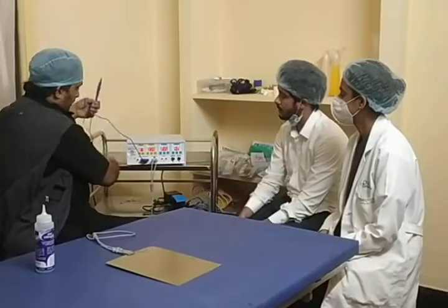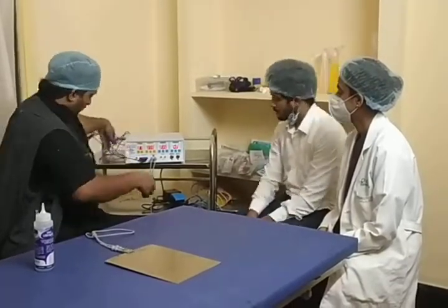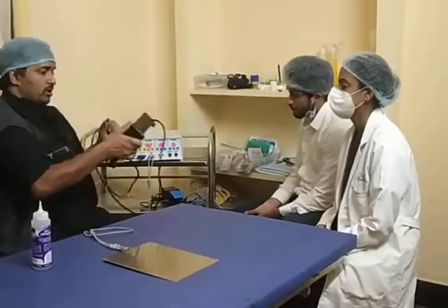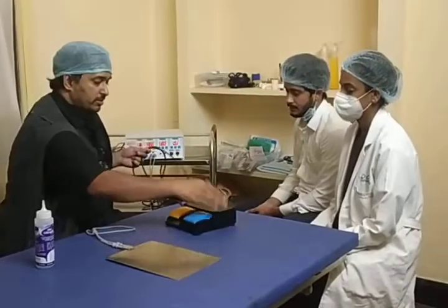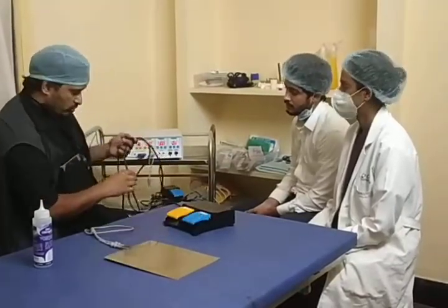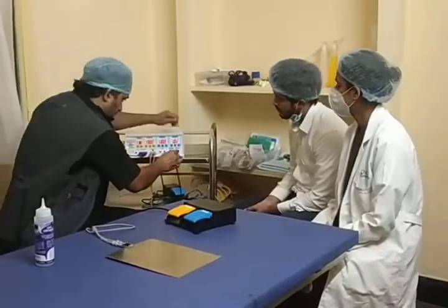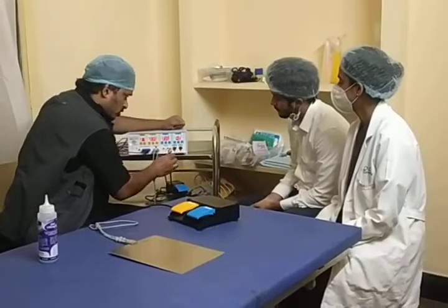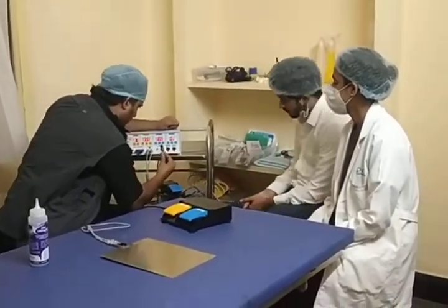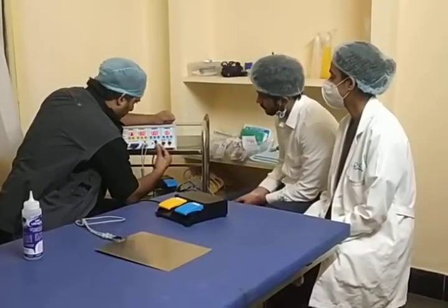Okay. And now let's see the foot operated one. The foot operated one is also an option. Now imagine, I want it to come in the video, so I'm going to keep it on the table. So this is the cut option and this is the coagulate option. It's a foot operated option. I'm going to connect this unipolar foot switch over here, and there are options over here. Again, it's very difficult to make a mistake because they fit exactly properly over here.